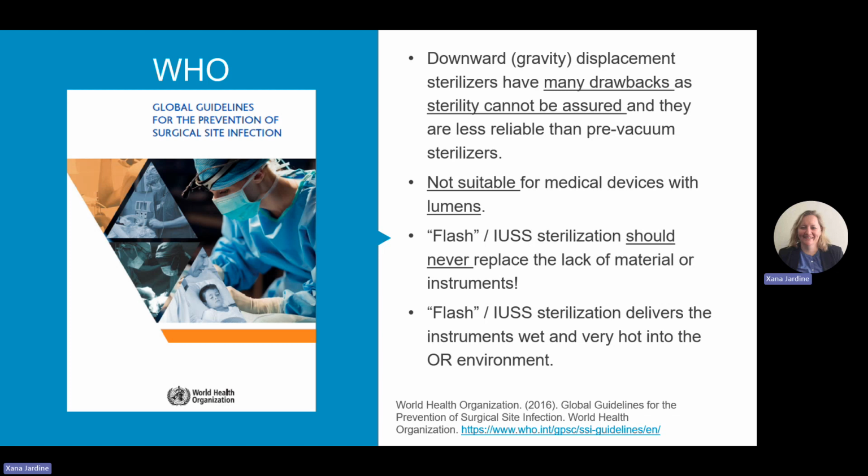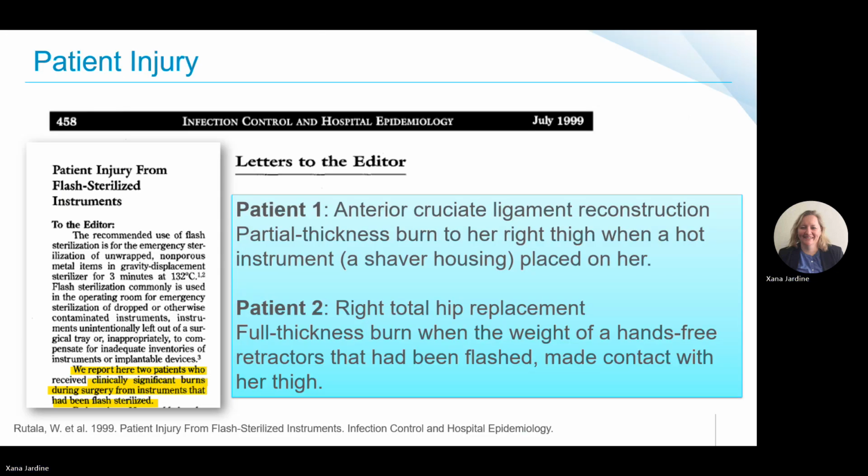And they say that, of course, you need to bear in mind the fact that immediate use sterilization delivers the instruments wet and very hot into the OR environment, and that in itself has another set of risks. This is a publication from 1999, a while ago, but a very relevant point, where 2 patients sustained burns because of immediate use steam sterilization.